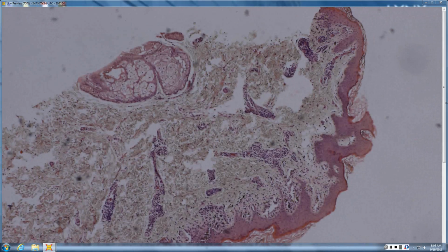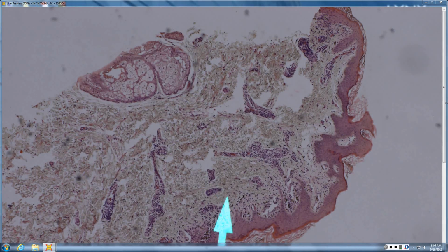Alright, so this one looks like a lichenoid interface. Looks like you have sawtoothing. So sawtoothing, it's lichenoid. Here, your pigment is pretty high. Really not much pigment down around the vessels. So more like an acute or subacute lichenoid process.